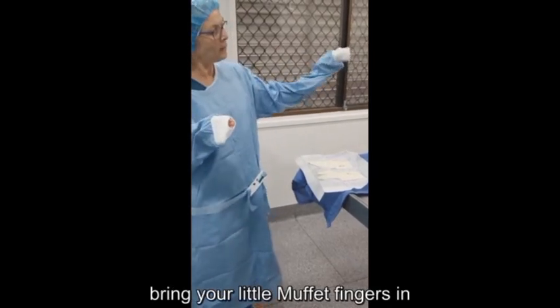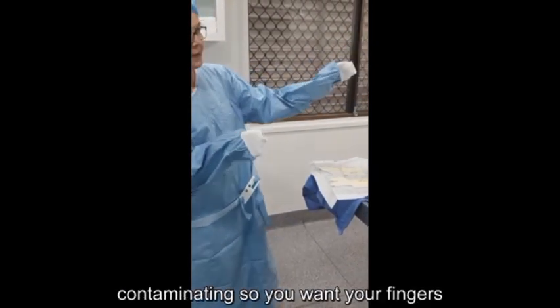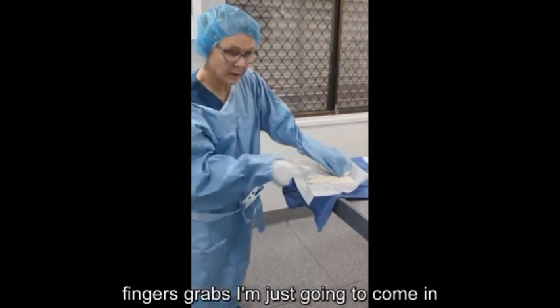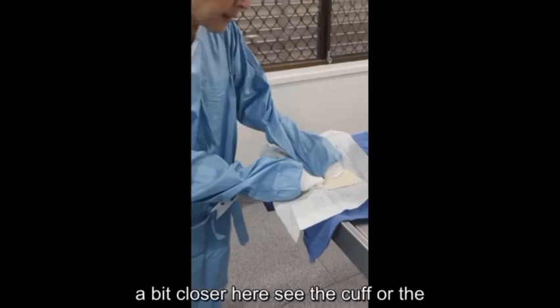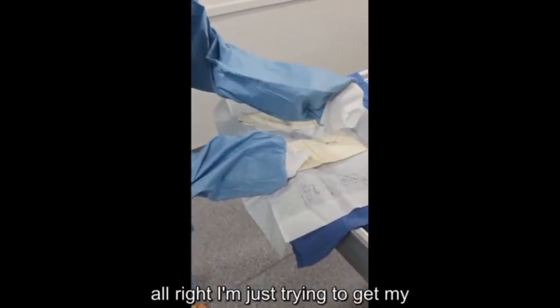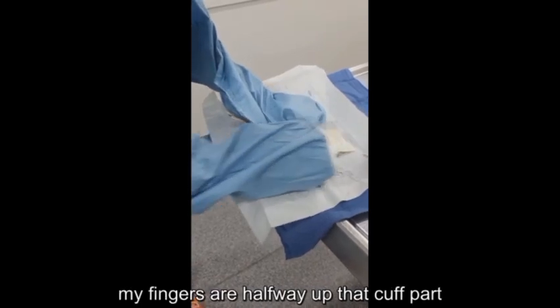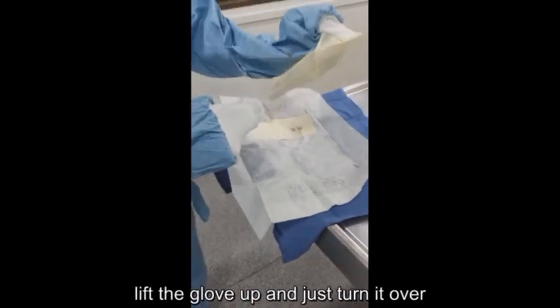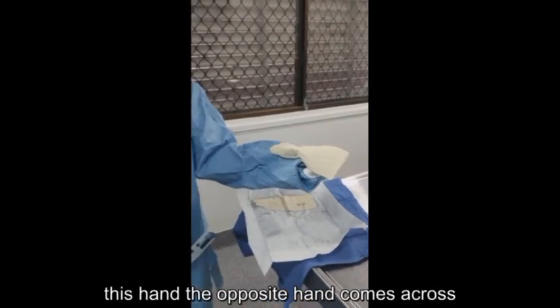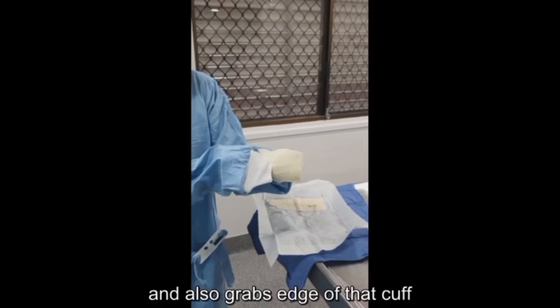So bring your little muppet fingers in. Don't stick them through because you risk contaminating. So you want your fingers to stay within the cuff. So muppet fingers, grab. I'm just going to come in a bit closer here. See the cuff of the glove there? I'm just trying to get my thumb to grab that bit, and my fingers are halfway up that cuff part. Lift the glove up and just turn it over so the fingers are laying down my arm. This hand, the opposite hand, comes across and also grabs the edge of that cuff.